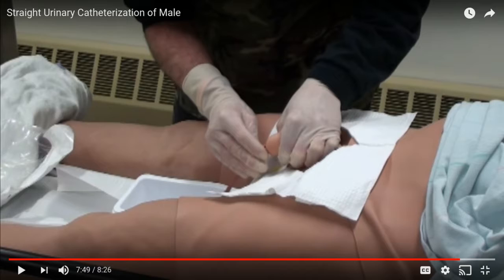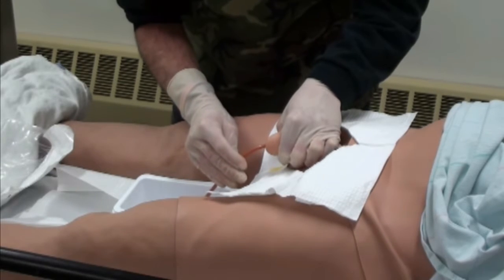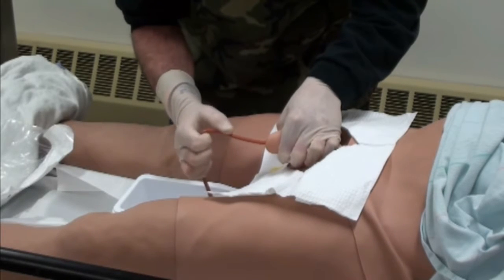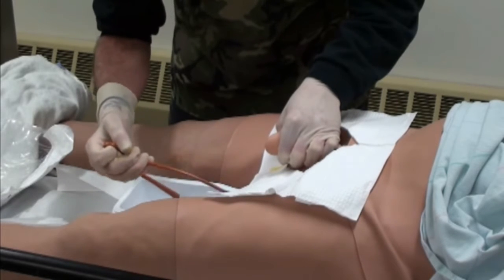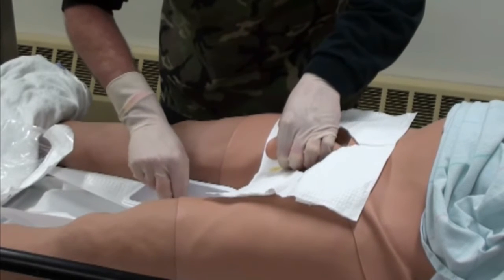If you were collecting a urine specimen, he would have kept the sterile container and he would have collected the urine in that container, and then the remainder of the urine from the bladder would have gone into that particular container. Gently retract the Foley a little bit so that you can empty the bottom of the bladder. When that stops, gently remove the catheter. Replace the foreskin to prevent compromised circulation or painful swelling. Clean the patient up and then properly document your results.